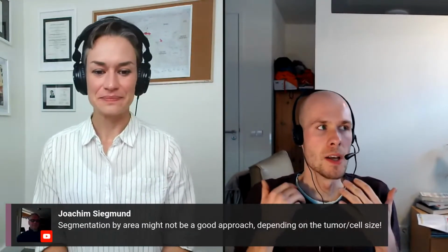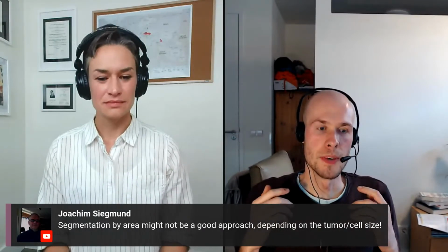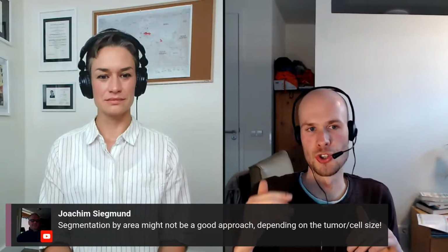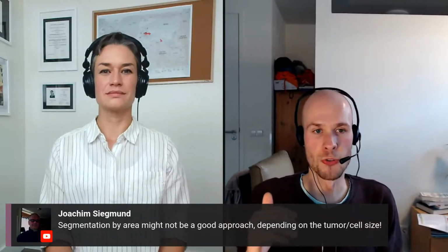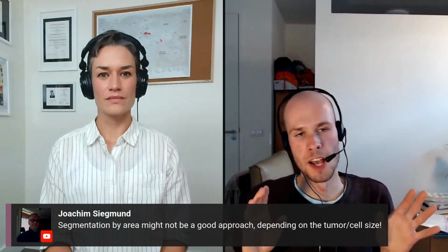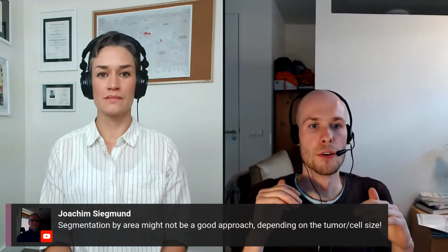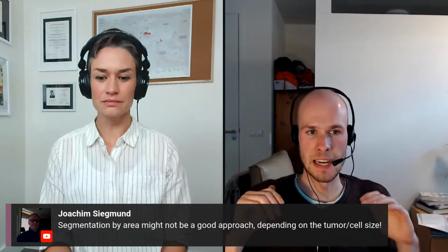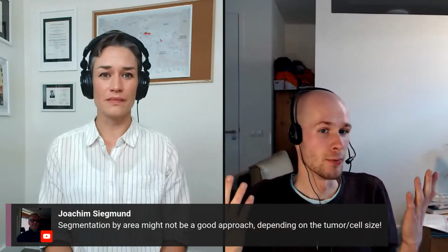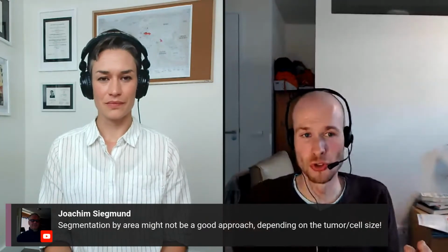I agree with the problem there: there is this underlying question of whether, if you purely do segmentation, you do an accurate job of representing the total number of cells. You could maybe argue that as long as the segmentation regions are large enough, the variability in cells kind of averages out, and then it's fine. But you don't know this, of course, until you empirically determine it.